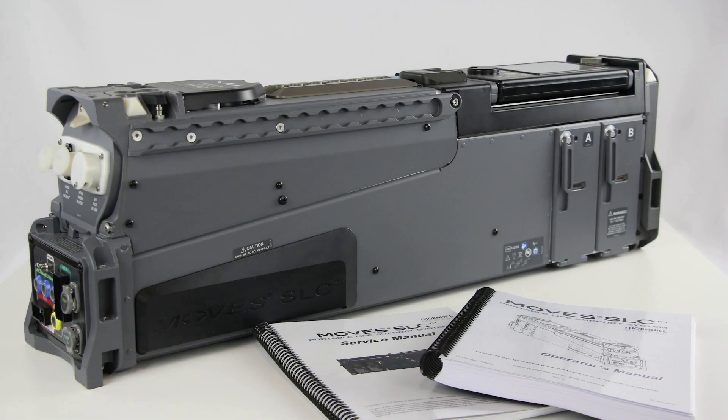Welcome to the MOVES SLC maintenance training video. This video was made to support periodic maintenance activities outlined in the MOVES SLC Operators Manual and the MOVES SLC Service Manual.